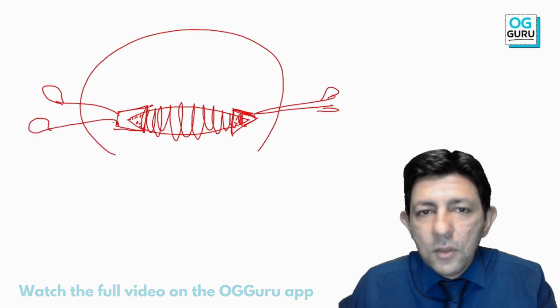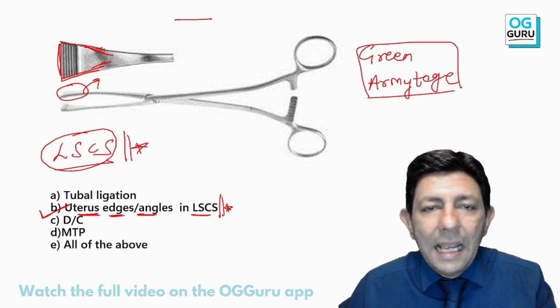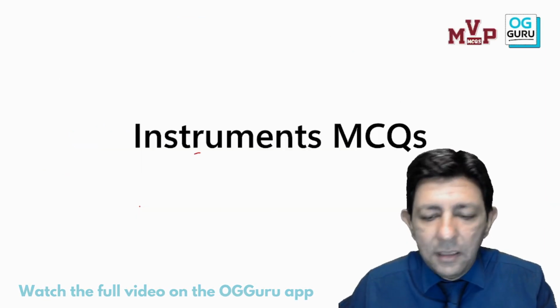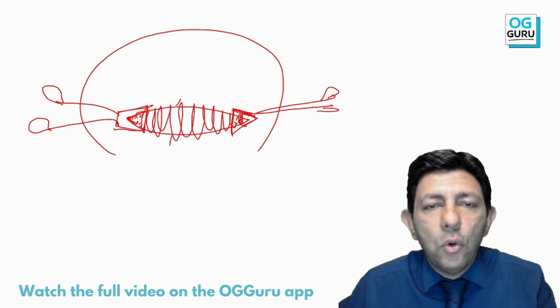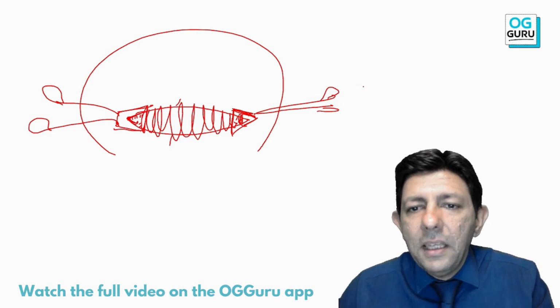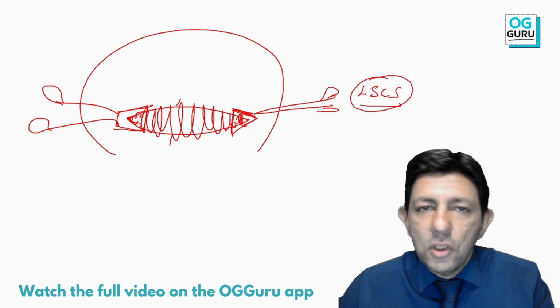So Green Armitage forceps is used to hold the uterine edges and the angles. This part is called the angle, and this is of course the edges. So it is used to hold the uterine edges and basically the lower uterine segment, where you made a cut in LSCS surgery.